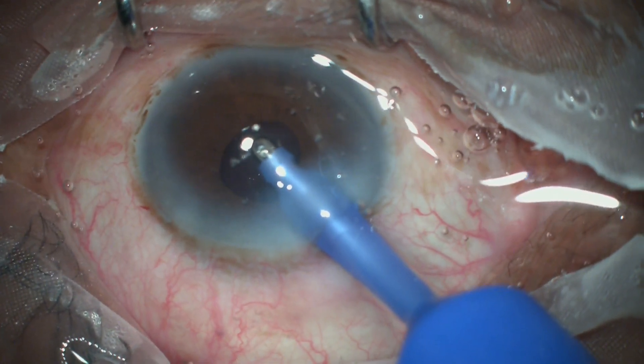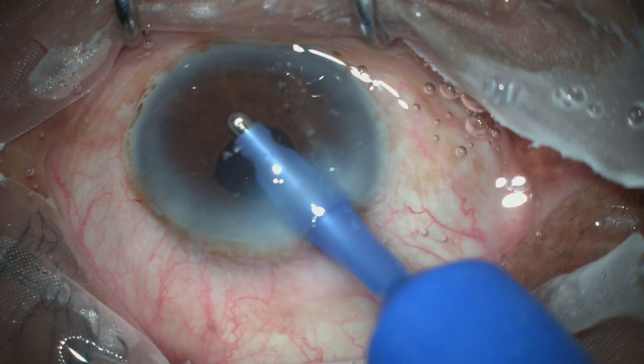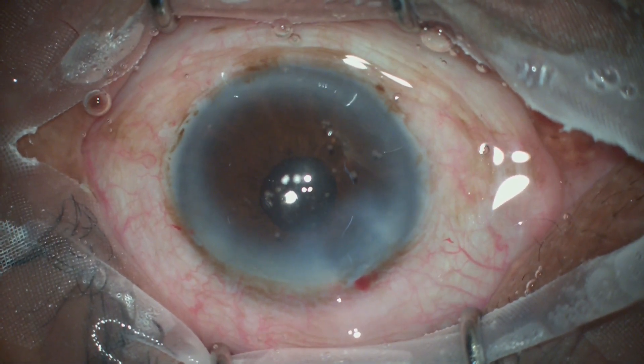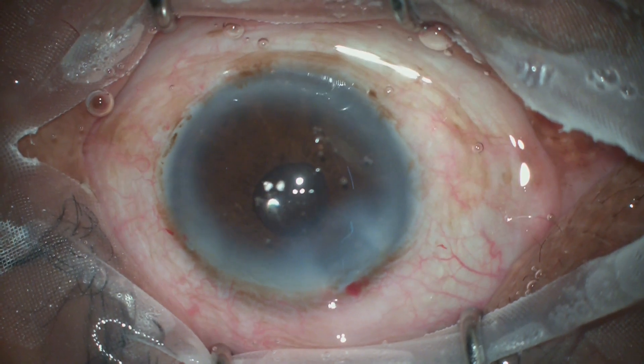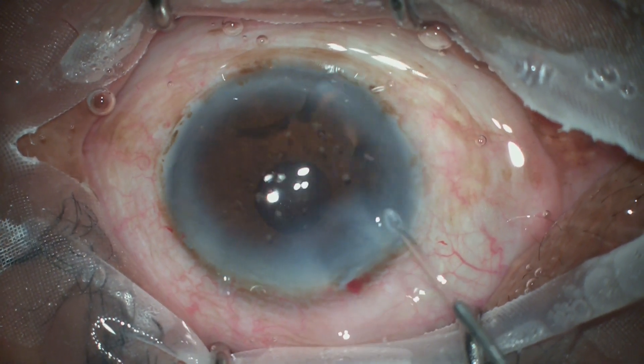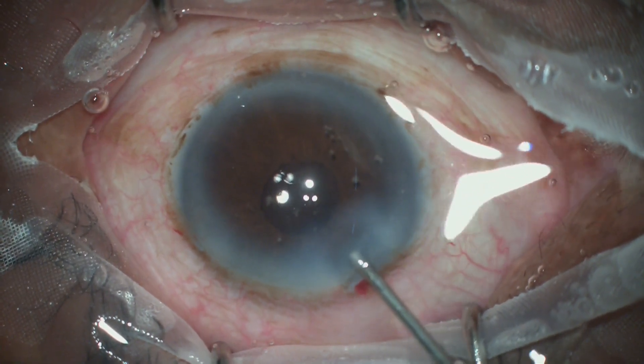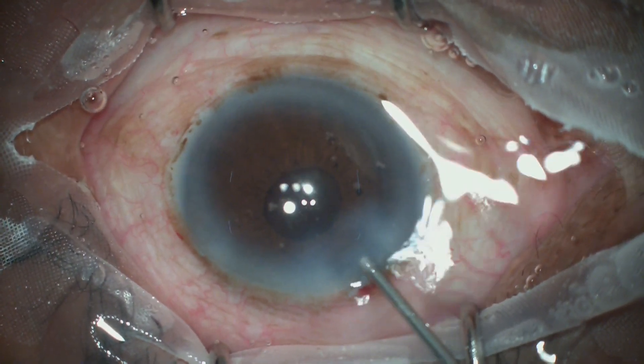This was an interesting case presenting a rare situation described in textbooks as true exfoliation syndrome, in contrast to pseudo-exfoliation syndrome where there is just a powdery deposit on the surface of the capsule. The anterior chamber is formed and the case is closed.